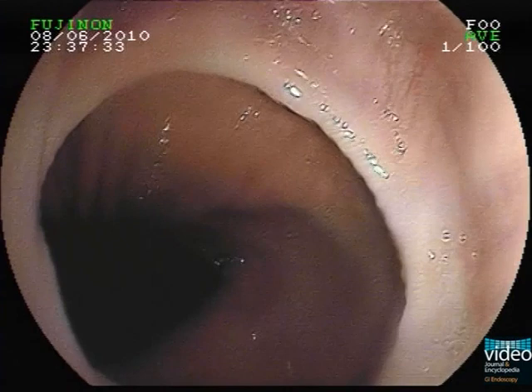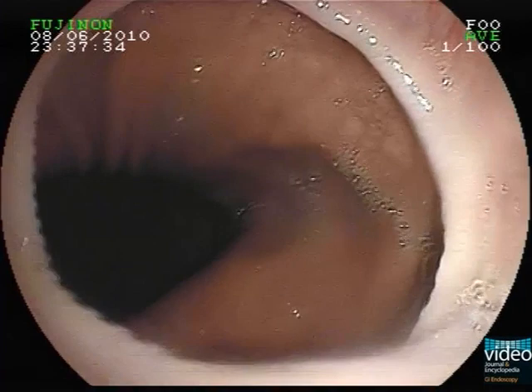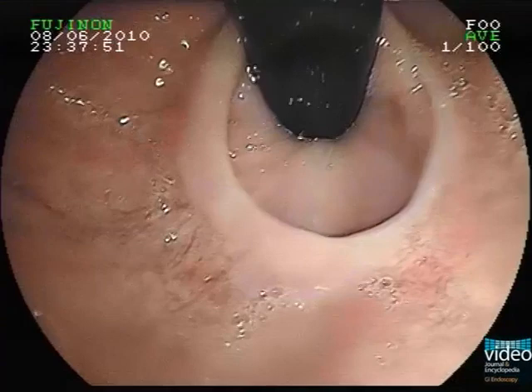This is a 56-year-old Caucasian female patient referred for upper endoscopy because of recurrent dysphagia. Directly at the esophagogastrojunction, a mucosal ring can be seen.